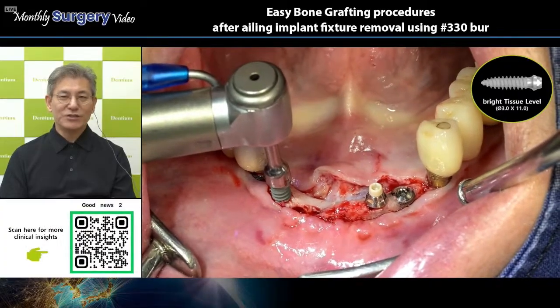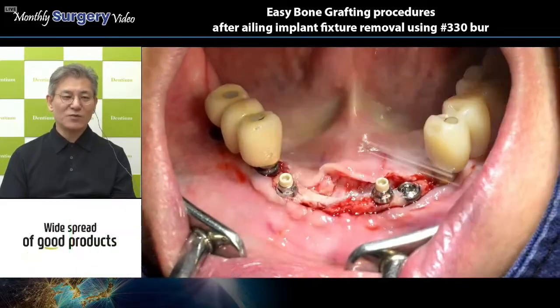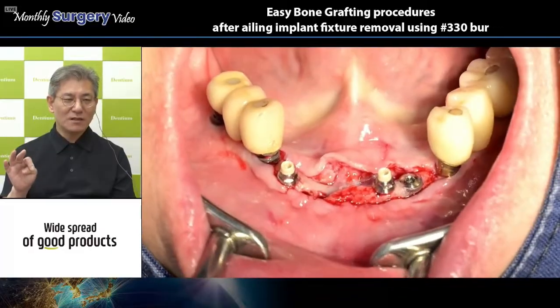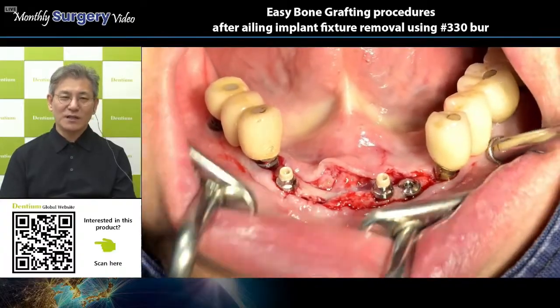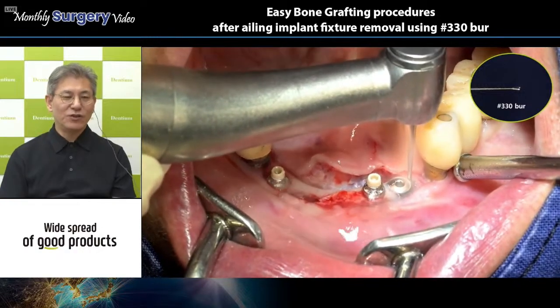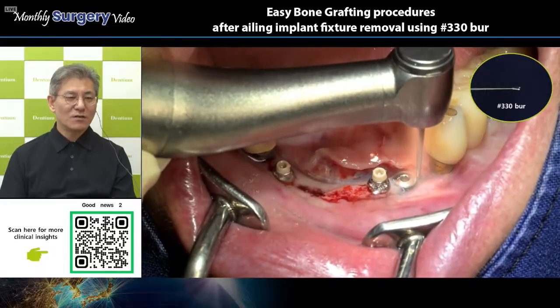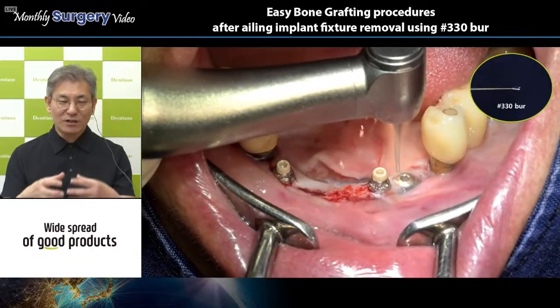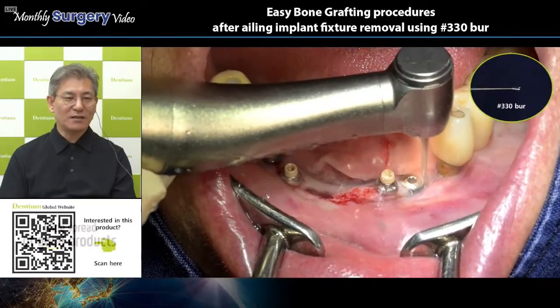The excellent installation. The osteotomy procedure is so simple. Did you see the drill procedure? High-speed bur, small indentation, Lindemann 1, and final drill, and then installation. Just only 3 drills and implantation. In the number 2.5 diameter case, actually 2 drills are enough to have the osteotomy and installation. So already done, 2 implant fixtures installed, and the precise installations accomplished at this implant site.